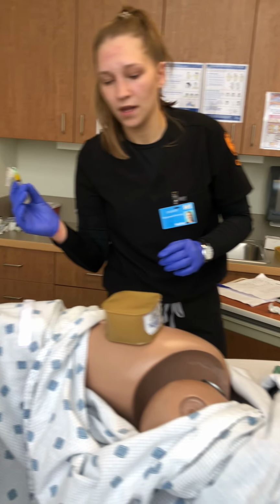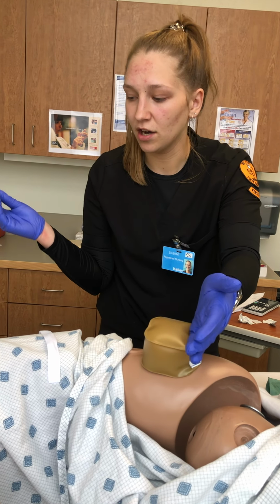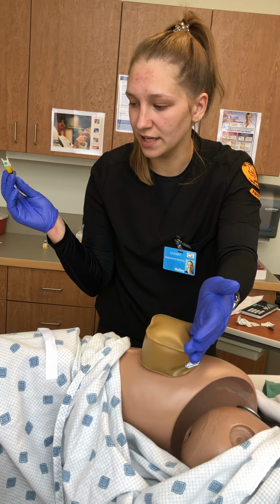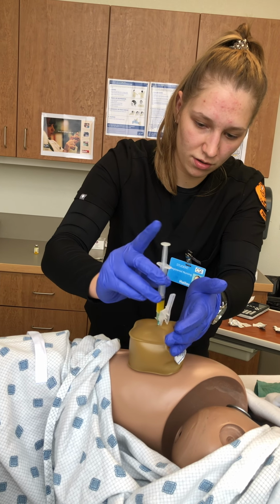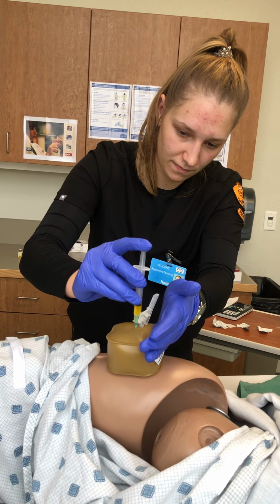Okay, Miss Betty, I'm going to perform the Z-track method and pull the skin taut again. On the count of 3, I'm going to go ahead and poke you with the needle and administer all of this, 10 seconds per 1 milliliter, okay? So on the count of 3, 1, 2, 3, poke. Push it in slowly.